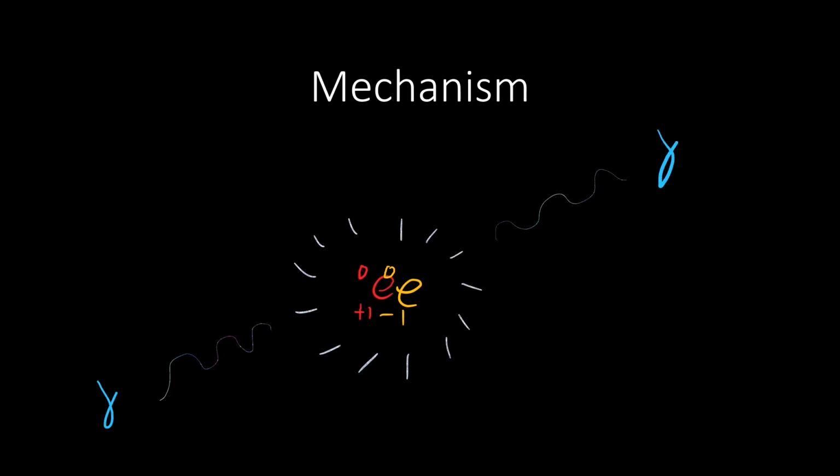A positron then travels through space, or tissue, before it annihilates with an electron. Combining matter, the electron, with antimatter, the positron, results in 2 gamma rays, a type of photon. These 2 gamma particles travel in opposite directions. This way, the momentum is conserved. The gamma particles are what we measure with the PET scanner.